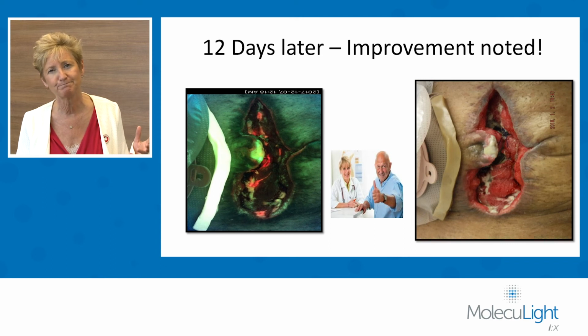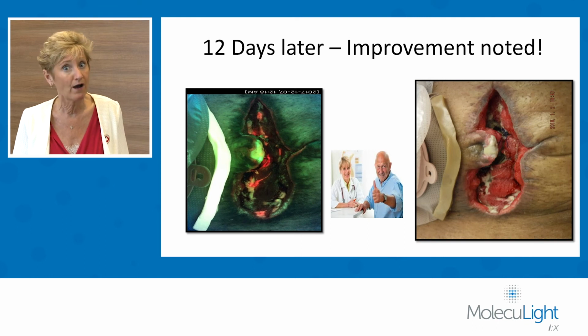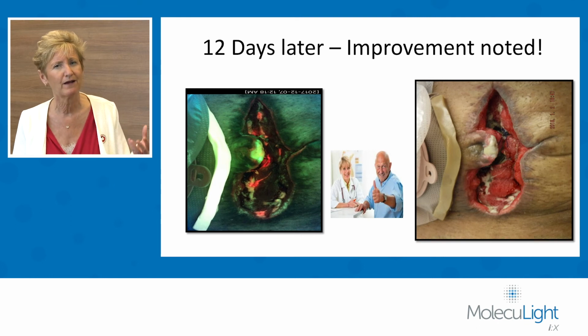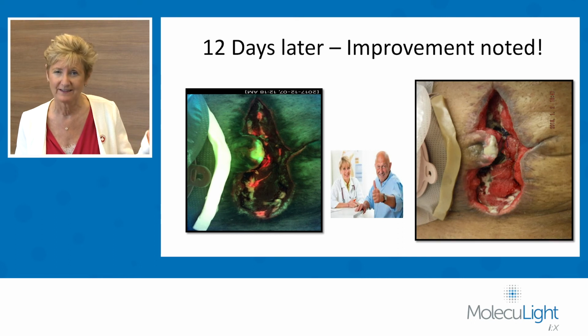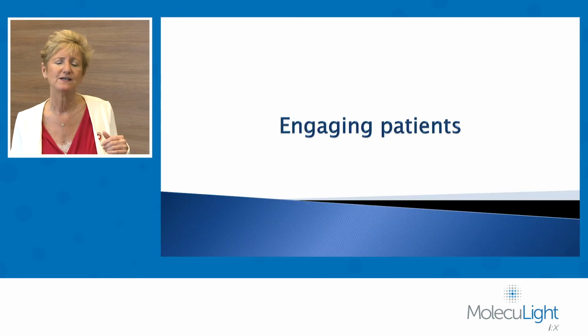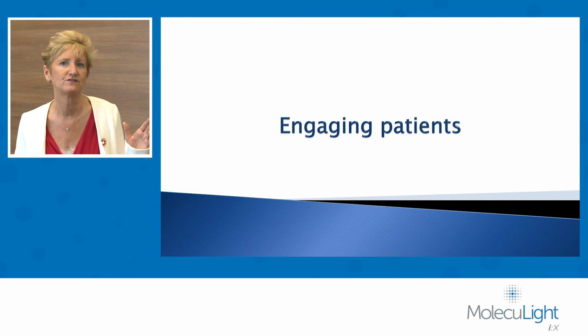There's a real patient engagement, dialogue about how their wound is doing and how they're improving, and it offers hope. I can use words like, wow, the granulation tissue is better, but when he sees the image of less red, that speaks volumes. So let's talk a little bit more about engaging patients.